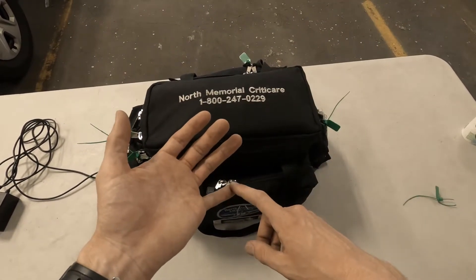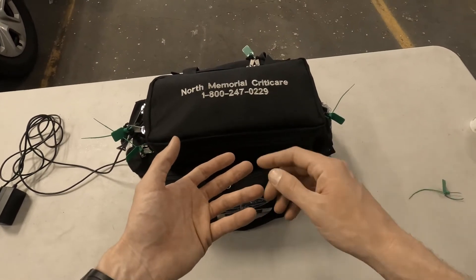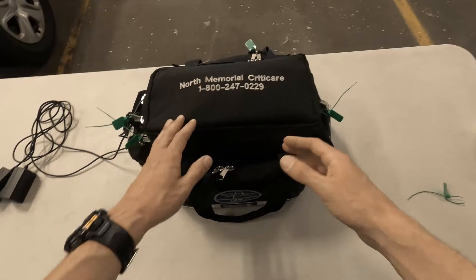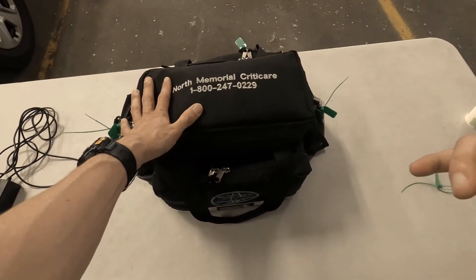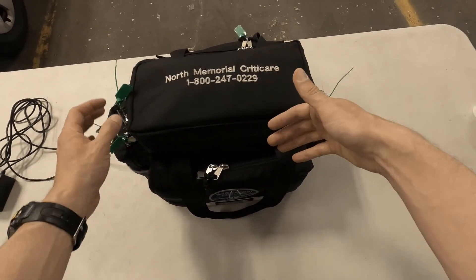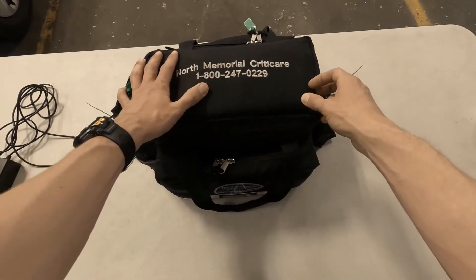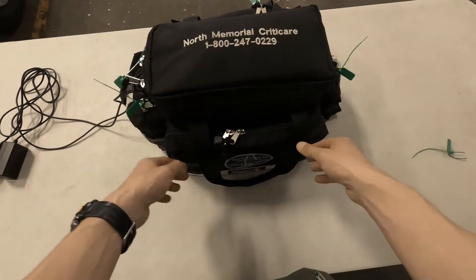Like if dispatch doesn't give you all the information, you could be ready with pumps, you could be ready with the art lines, you could be ready with meds, vent supplies, that kind of thing. Whereas beforehand you were running all the way back down and weren't really prepared for anything. So I'm going to run through some of this stuff so you can get your eye on some of the changes if you haven't gone through the bag since then. And if there's still questions after that, you can come to me and I can make another one of these videos.